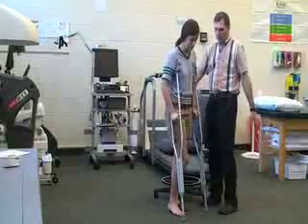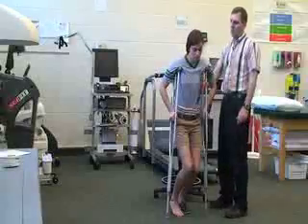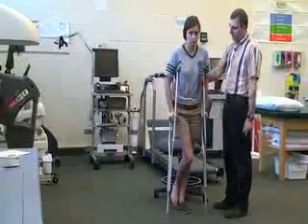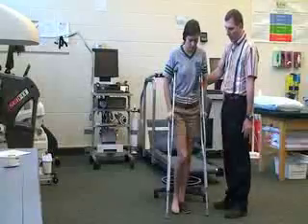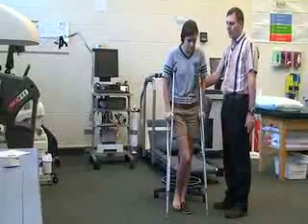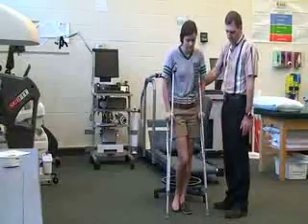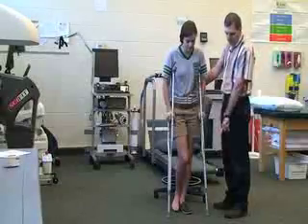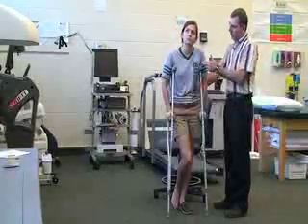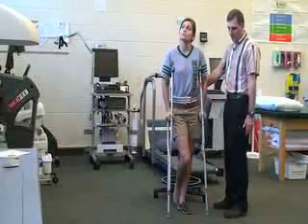Next you want to instruct the patient that when standing on the crutches she should not put weight on her shoulders, because she can develop crutch palsy — a neurological condition caused by pinching the nerves under the armpits. Make sure she's putting all the weight on the palms of her hands as well as sharing the weight on the good leg, which is her left leg. Also tell her to make sure when she starts walking that she takes a normal stride, about a foot or two in front of her. You don't always want to rely on the numbered settings — always verify the elbow bend and hand placement because some crutches do not have those numbers.